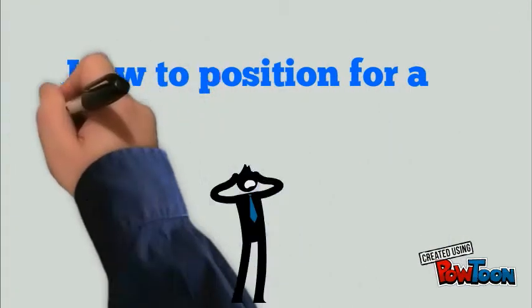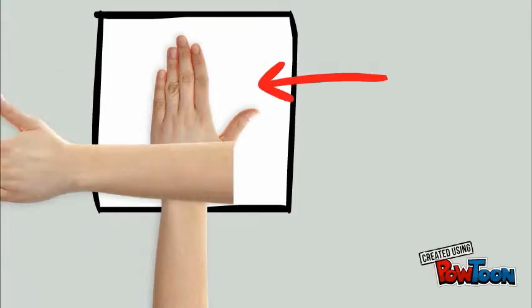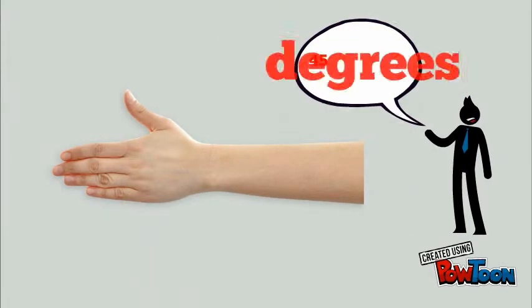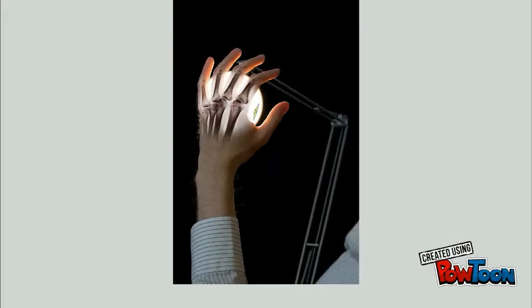Positioning the hand for the DP oblique. Again, the cassette is placed under the hand and in the middle. However, this time you externally rotate the hand by 45 degrees. This means to put the hand onto its side and let the other fingers drop onto the cassette. The hand should look slightly clawed.